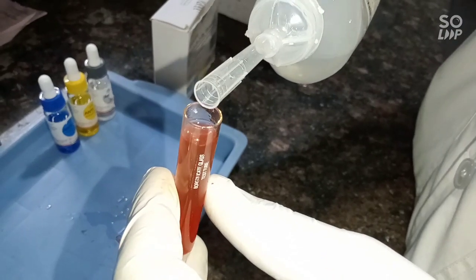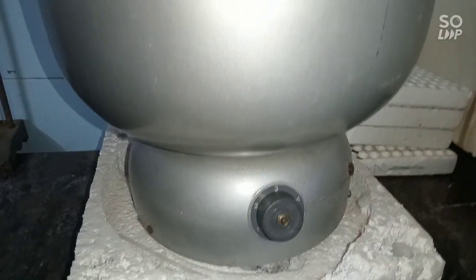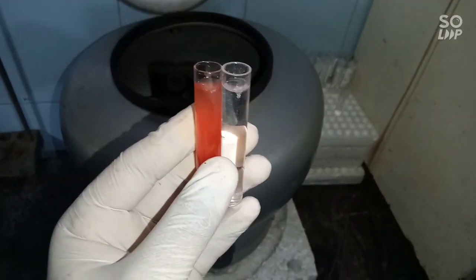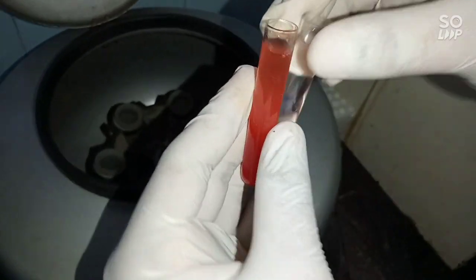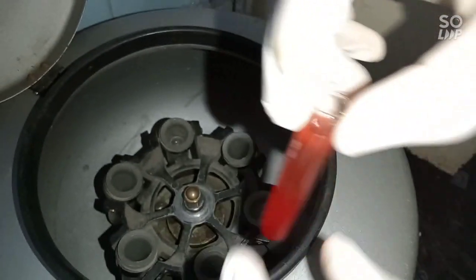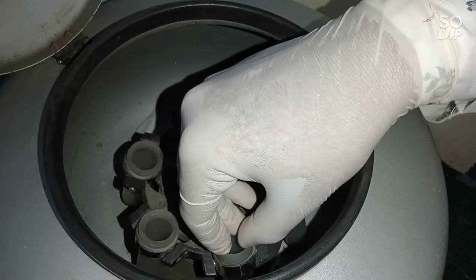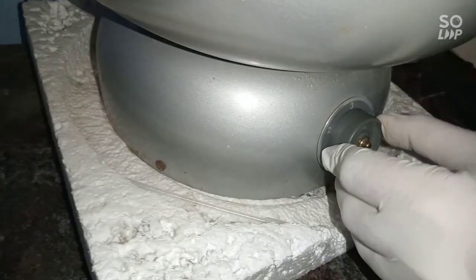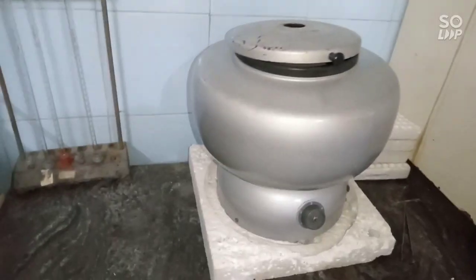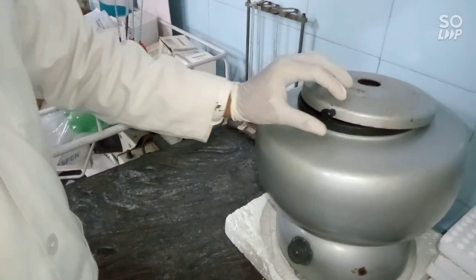Then centrifuge this tube at 2,000 RPM. Maintain the balancing in the centrifuge correctly, positioning tubes in opposite directions. Start at 2,000 RPM for one minute. Our technician today is Fayyad Raziuddin. After one minute, take out the tube carefully.